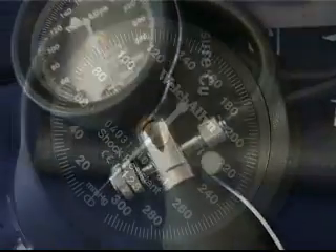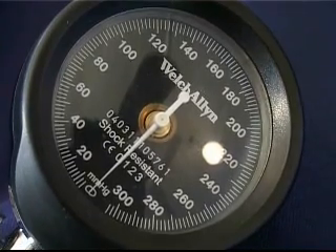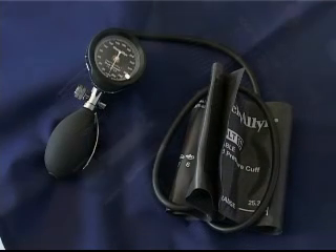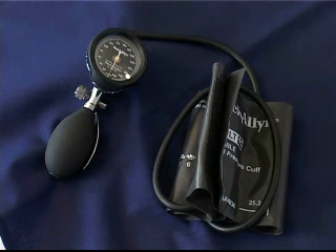An aneroid sphygmomanometer consists of a dial with the same millimetres of mercury markings around the dial from 0 to 300 mmHg, and the same type of adult cuff, inflation bulb, and air flow control valve.